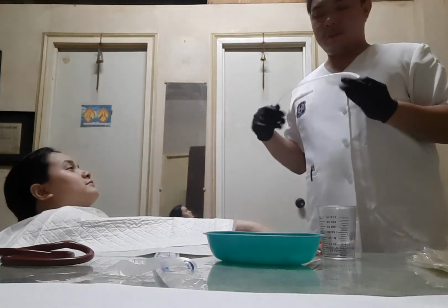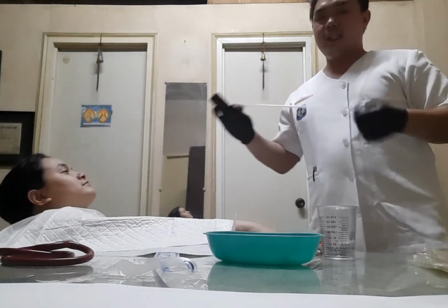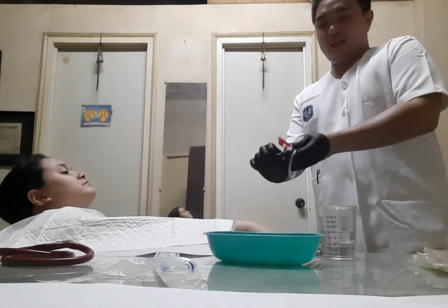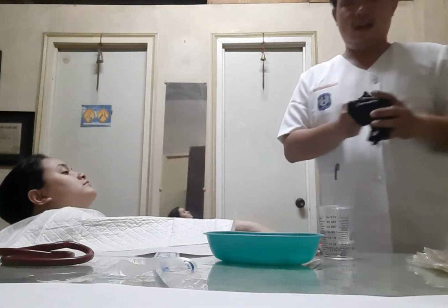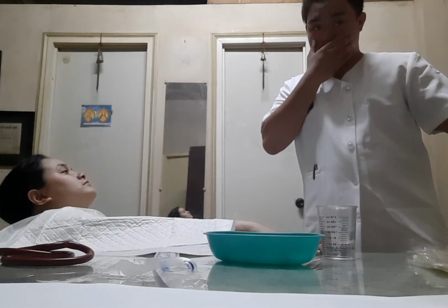So after doing the suctioning, we might fold this like this, remove our glove, and then discard it, assuming that there is a trash bag.